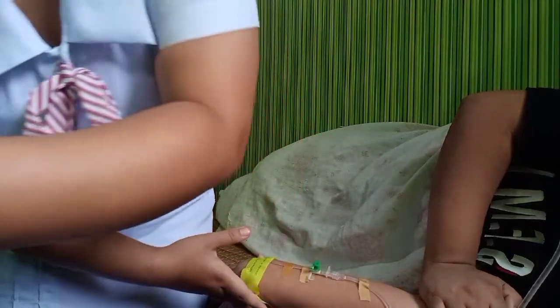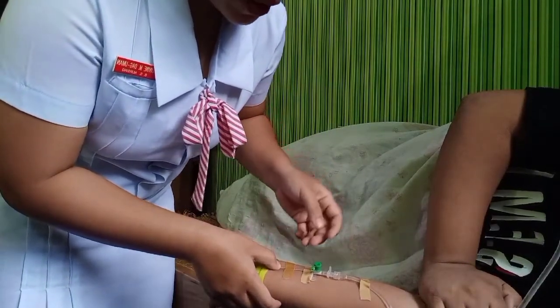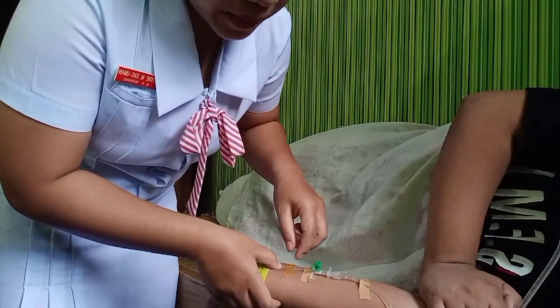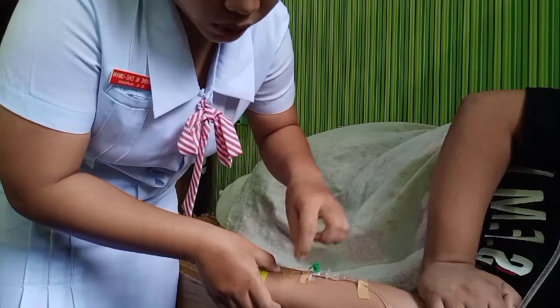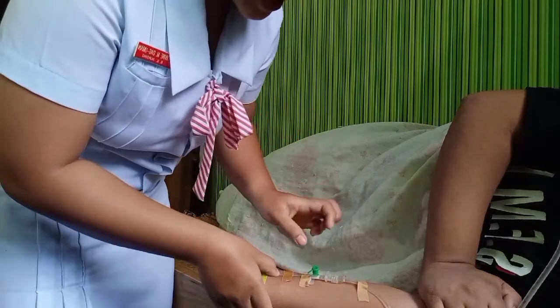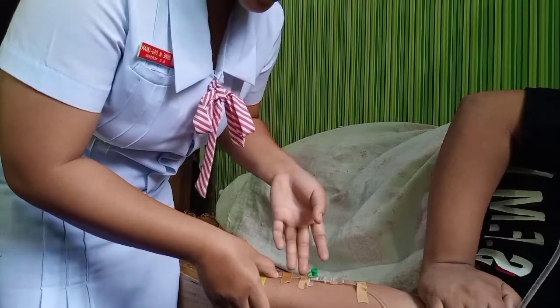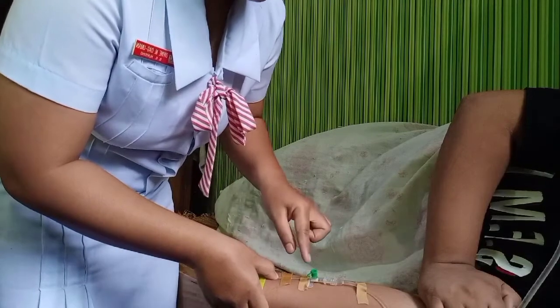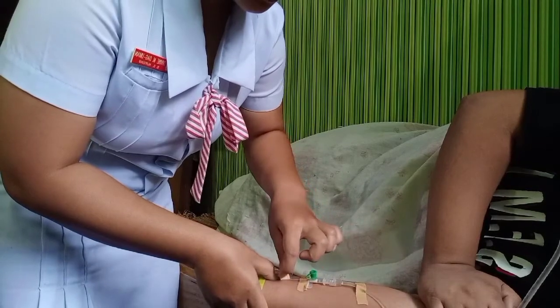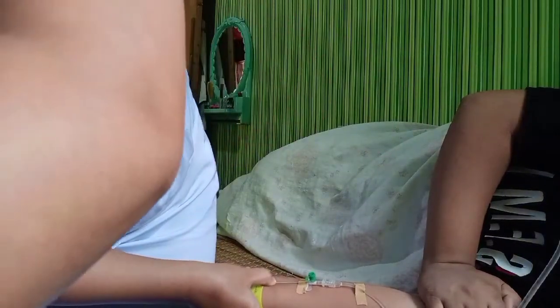We need also to consider the direction of the hair growth of the patient, because this is to avoid pain in detaching the plaster. For this patient, the body hair is going to the right, so we are going to detach the plaster to the right also. And then we need to put it in the waste receptacle.